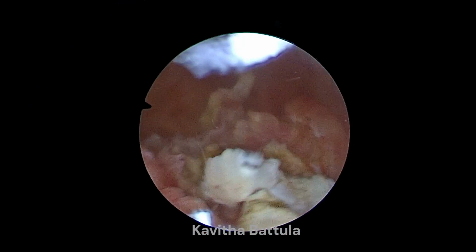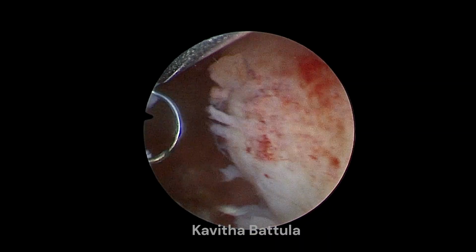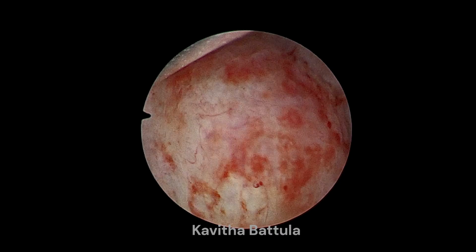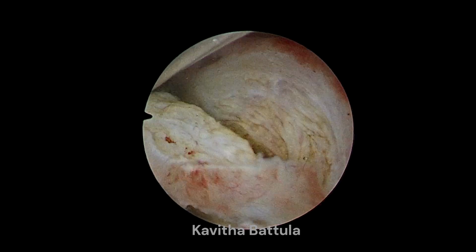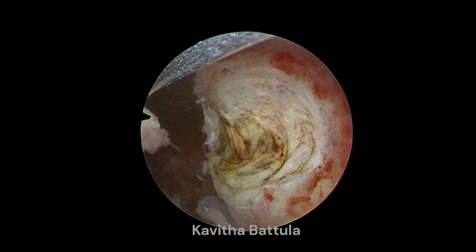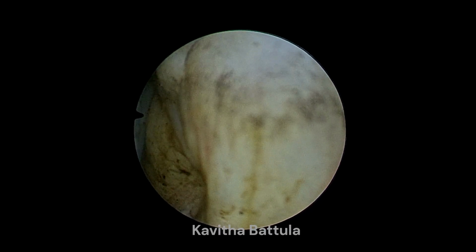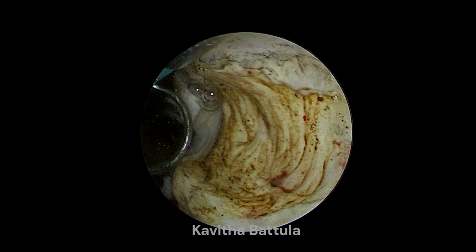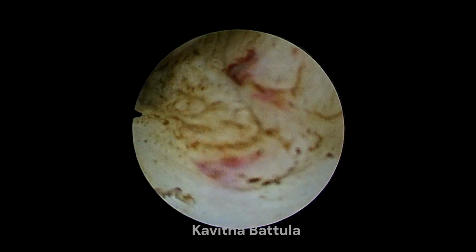So we can use the mini resectoscope when the lesions are small, less than 2 centimeters. The advantage of this is that we don't need to dilate the cervix too much. A 26 French is too big for resection. This can lead to damage to the cervix and later cervical incompetence. So, the mini resectoscope is advantageous in this aspect.